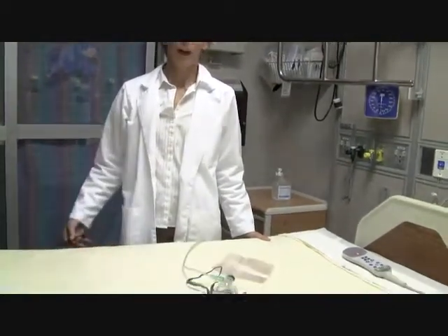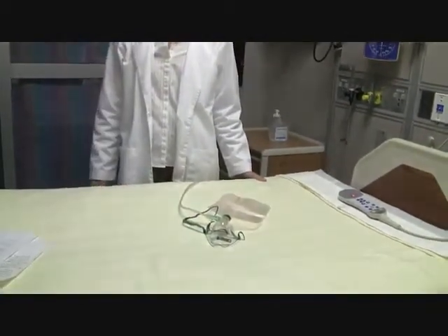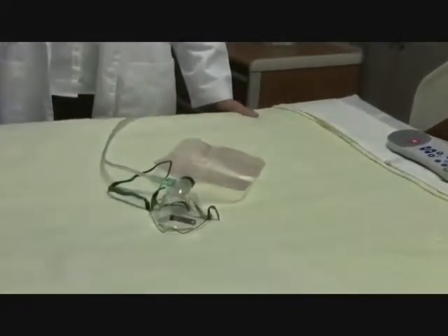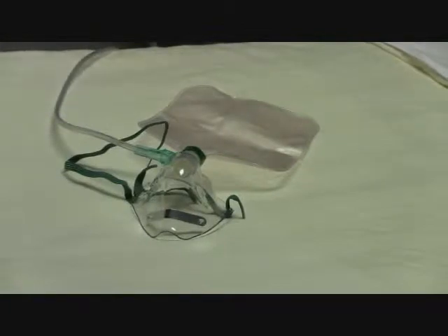Now lastly, we're going to discuss the non-rebreather mask. This mask is most commonly used in emergency situations. For example, if the nurse feels that a cardiac arrest or respiratory arrest seems imminent and the patient's endangered, the nurse might run and get a non-rebreather mask. It supplies the highest FiO2 of all non-invasive delivery devices.